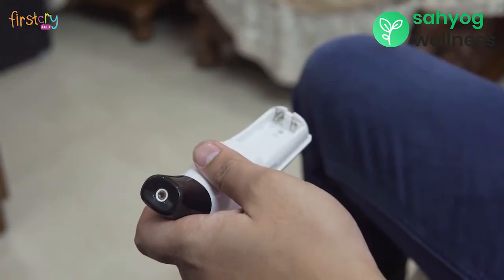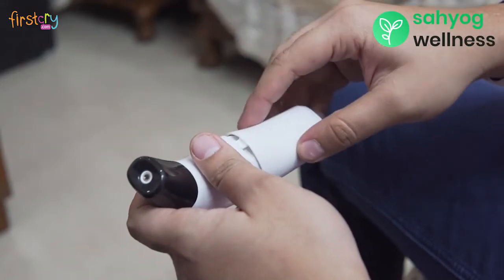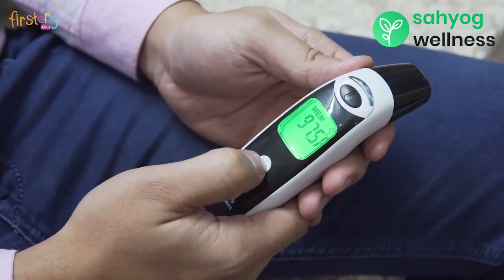To get started, insert two AAA batteries. Switch on the thermometer by pressing the white button.